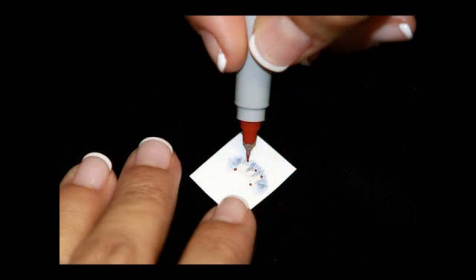Mark the tip of the lobes with an ink pen such as a Sharpie. Placement on the tip of the lobes allows us to determine how far the lobes are from the incisal edge. Mark the measure on the distal dentinal border to help center the image and to create the correct long axis.